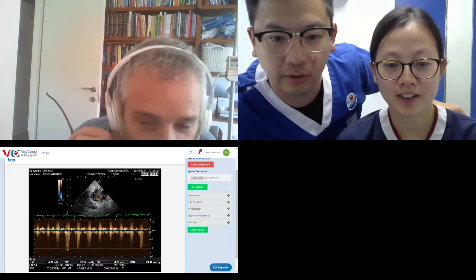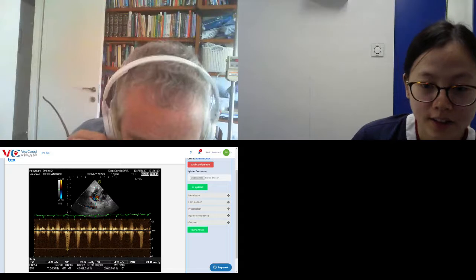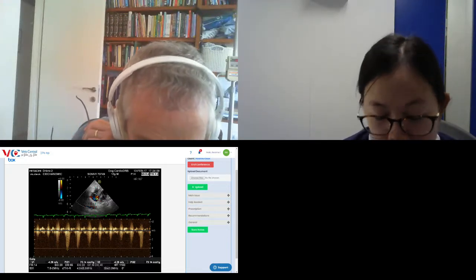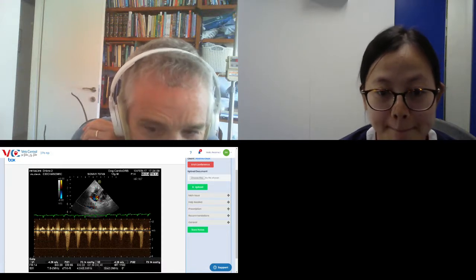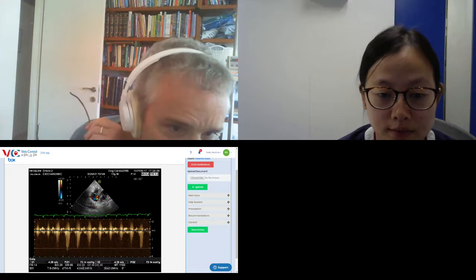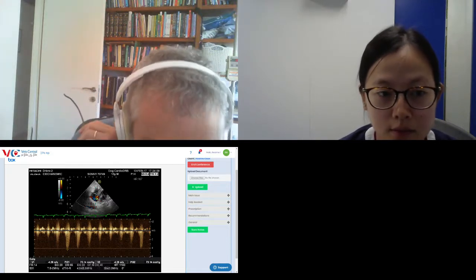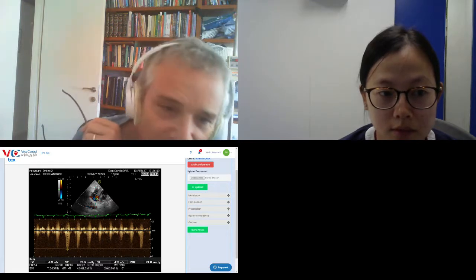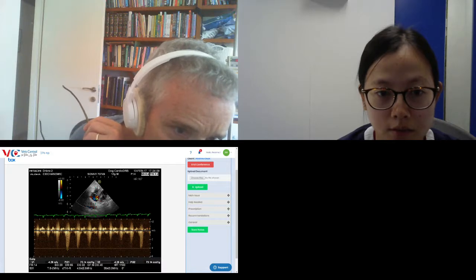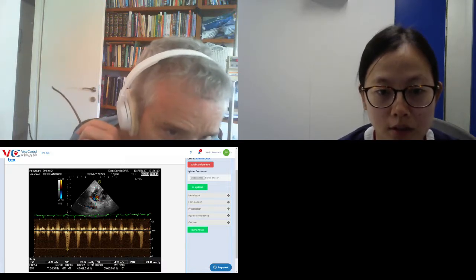So right underneath the green line I made, you see 73.14 millimeters of mercury. Can you see that on your screen? Yes. This means this is the pressure gradient, the systolic pressure gradient between the right ventricle and the right atrium. 73 is about 5 times norm. It's a 5-fold increase in pulmonary systolic pressure, which is elevated for sure.